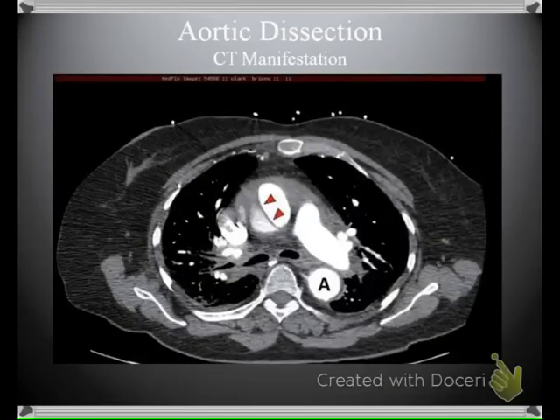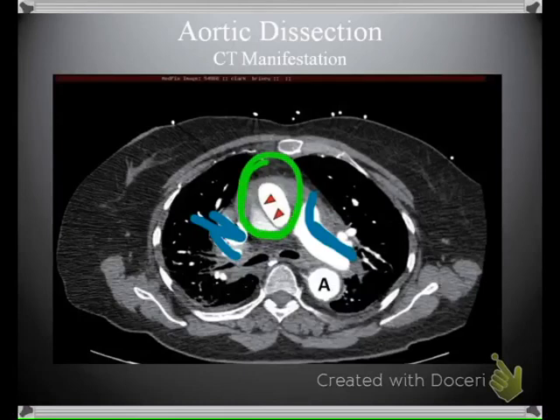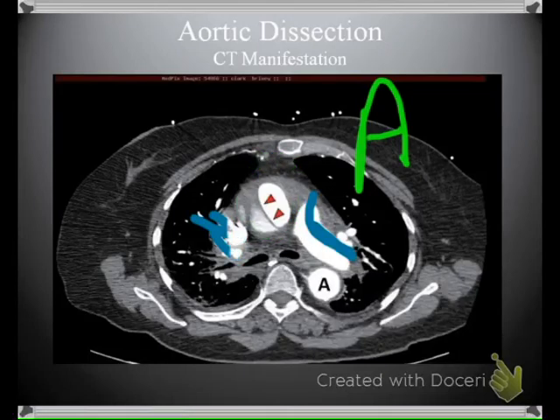Okay, on this one, we can notice the proximity or the location, and we do see that we have the pulmonary arteries here. We do have the left pulmonary artery coming there, and we're seeing the right here. So this means that we're slightly lower in the chest than the previous image, but one thing to notice is this area here. This will be the ascending aorta, and which makes this a type A aortic dissection. And if we'll notice, this is very detrimental to the patient's health because you're basically looking at a dissection right as the aorta emerges from the heart, which can be extremely difficult to get to and repair.